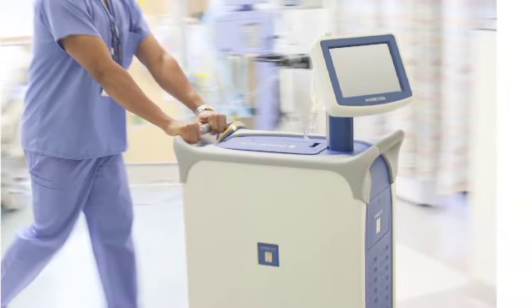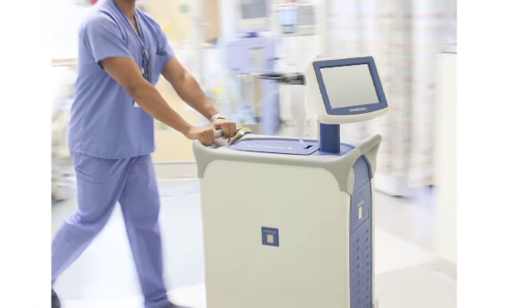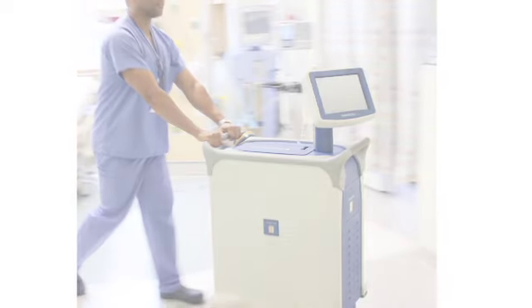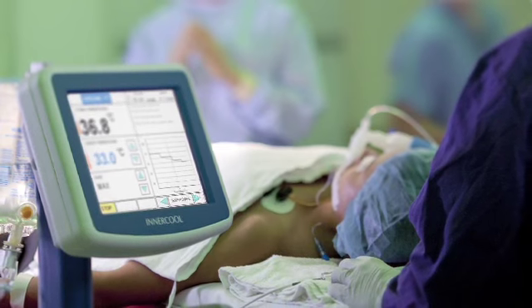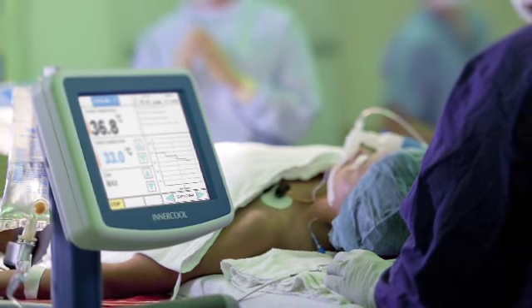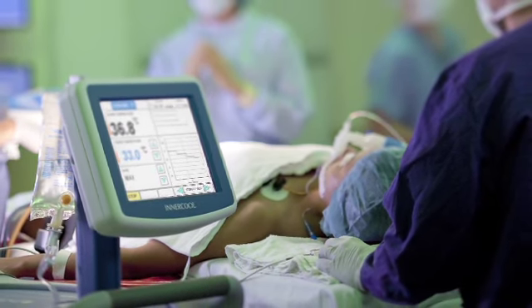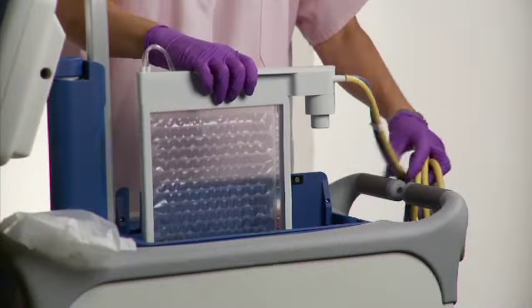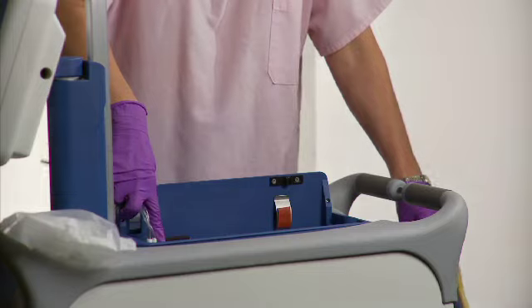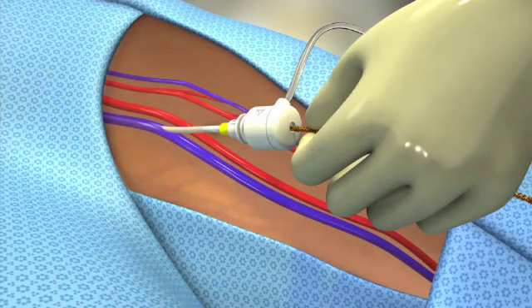The InnerCool RTX system provides therapeutic endovascular temperature management that can rapidly induce, maintain, and reverse mild to moderate levels of therapeutic hypothermia. The system consists of the InnerCool RTX console, which precisely controls the temperature of a balanced electrolyte heat transfer fluid. It warms or cools the patient by circulating the fluid through a disposable proprietary cassette-based circulating set connected to a heat exchange catheter that is inserted through the femoral vein into the inferior vena cava.